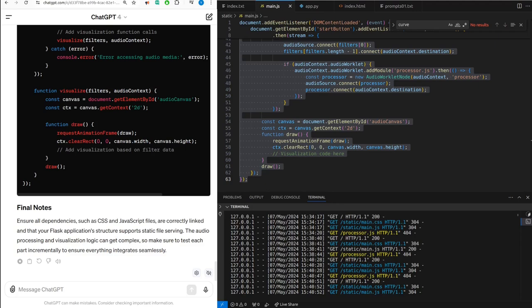Ensure each filter connects not only to the next filter, but also appropriately to each component, envelope followers, compressors. Your current chaining might miss some connections, leading to some filters not properly being processed. The current setup for the envelope followers doesn't actually process any audio signal. You need to ensure the rectifier shapes the signal. You can use a simple function for full-wave rectification, and then it should be passed through a low-pass filter.